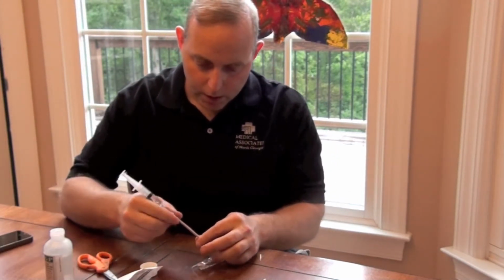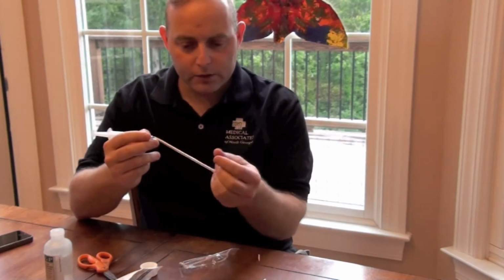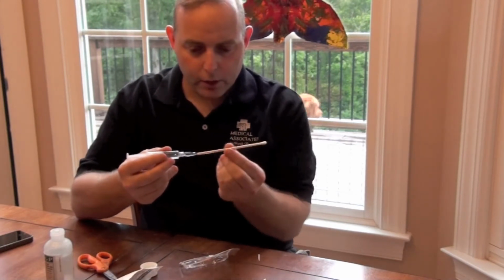And since it's for me, I'm just going to goo it up and lubricate the end with the lidocaine so it slides down easy. And now we are essentially ready to go.